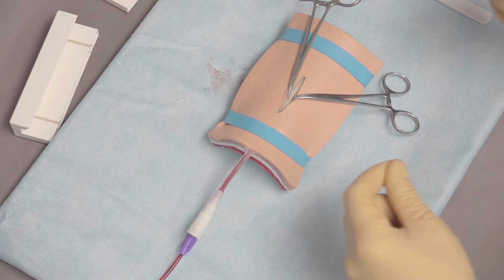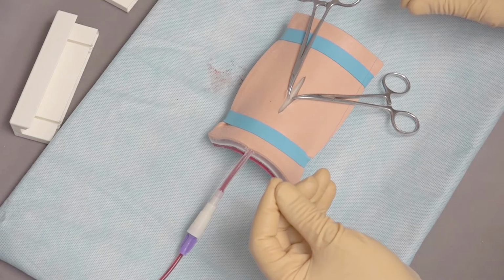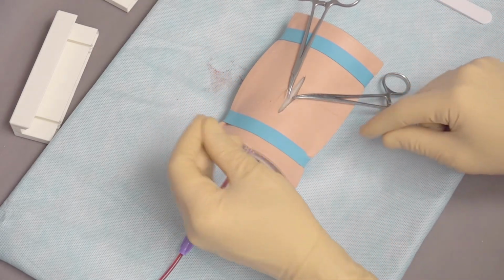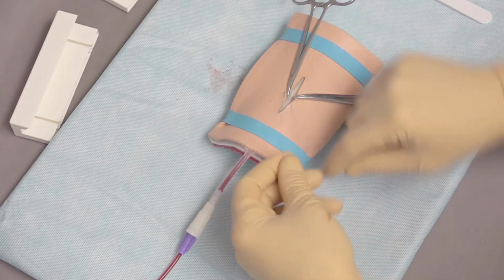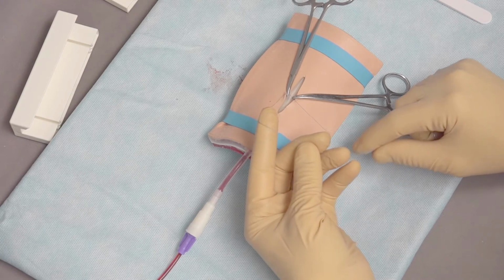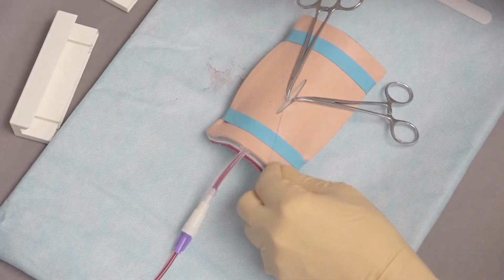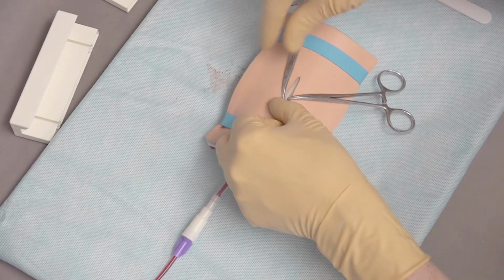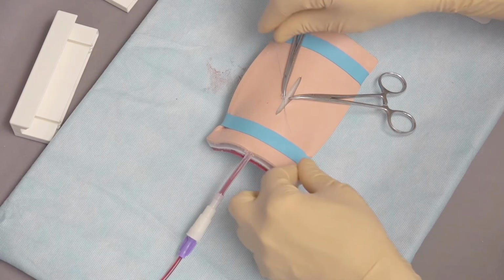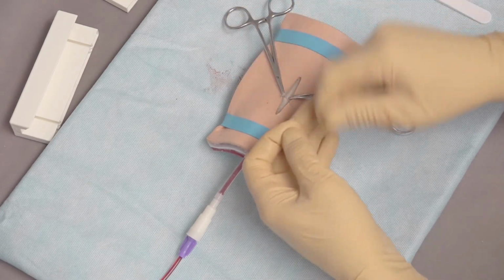Now we're going to take some suture. In this case, a smaller diameter absorbable would be ideal. And we're going to come around the hemostat itself. And then we're going to use a hand tie. So in this case, we're going to do a one-handed tie. We could use an instrument tie as well. Take the suture around, and we're going to make sure that we place the loop of the suture down and around the vessel. Just tighten that down, being careful not to over tighten, otherwise it will tear the vessel.